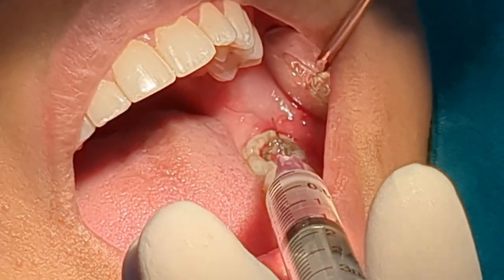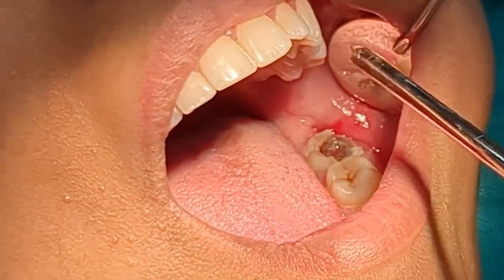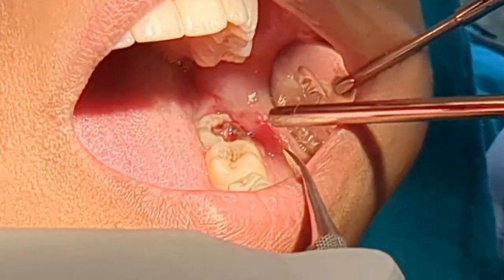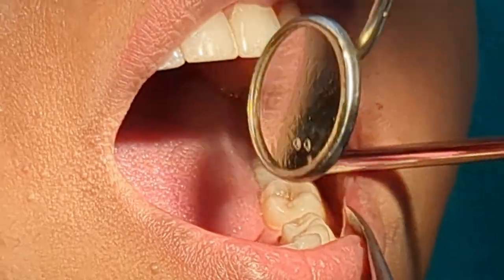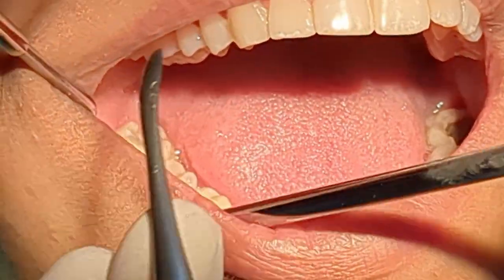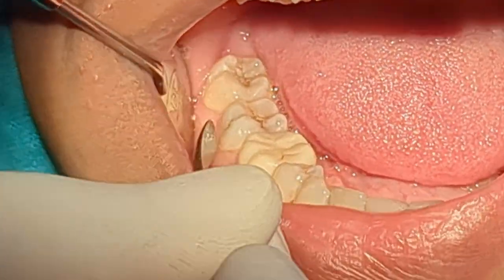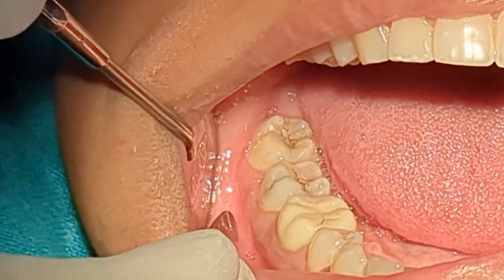Now take a deep breath. What I do in all my patients is first I show the patient what actual pain is. I am going to poke the mucosa on the opposite side, where I have not given the LA, with the blunt end of the periosteal elevator.